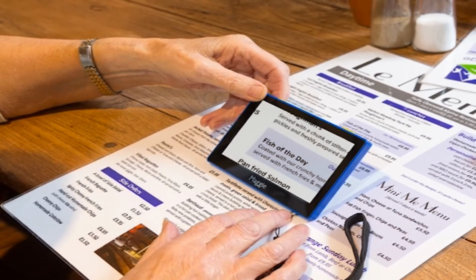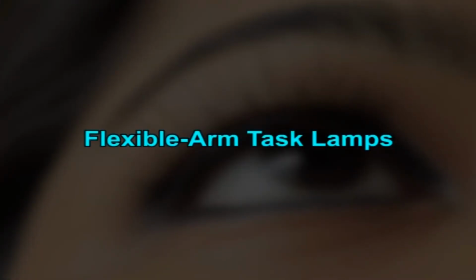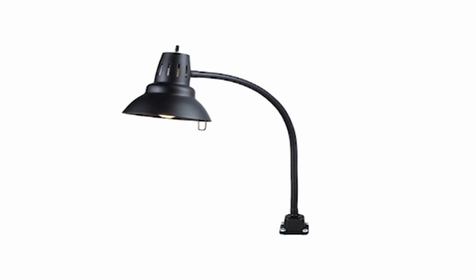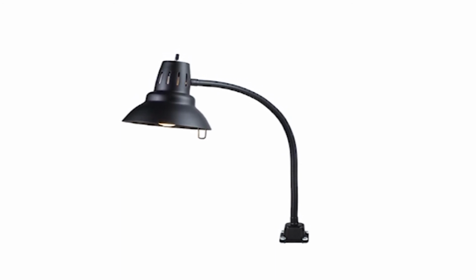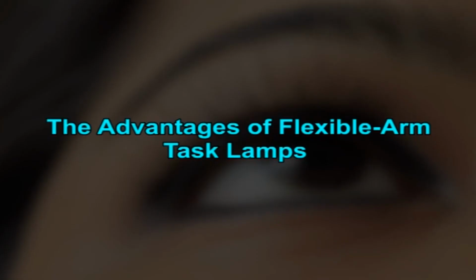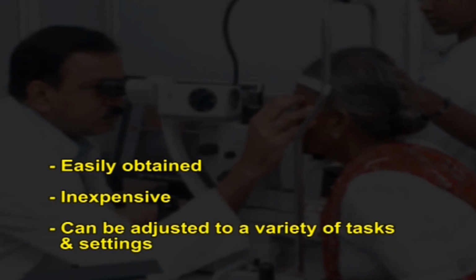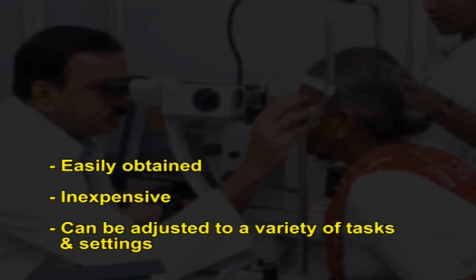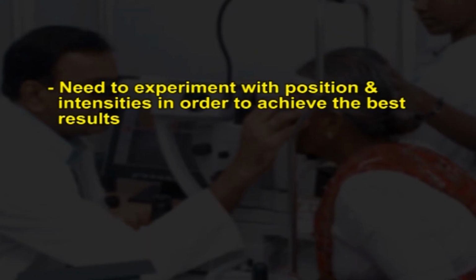The most common low vision non-optical devices include flexible arm task lamps. Because proper lighting is critical for good vision, flexible arm task lamps are the leading non-optical devices for many people. The advantages of flexible arm task lamps are easily obtained, inexpensive, can be adjusted to a variety of tasks and settings.